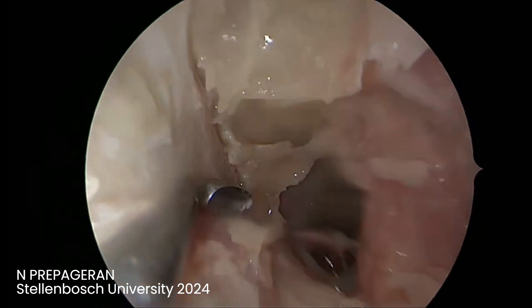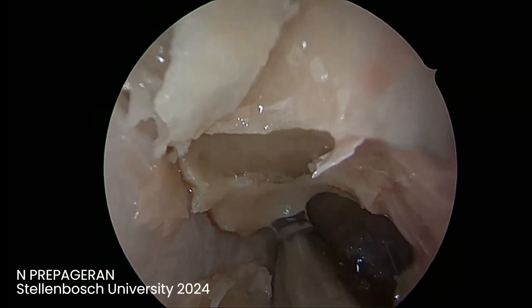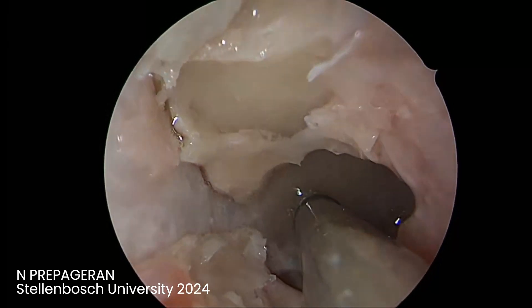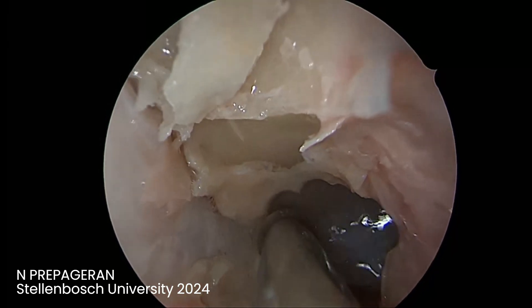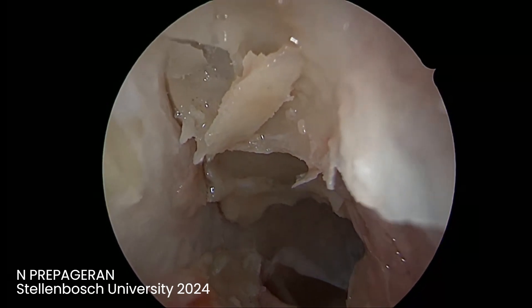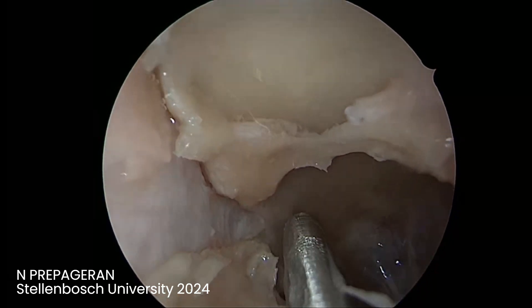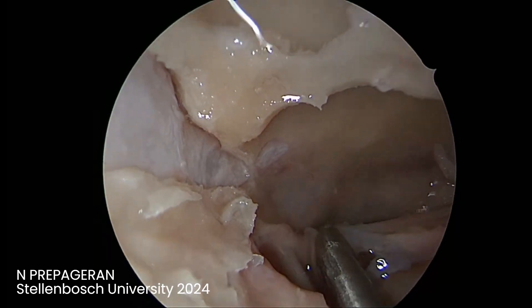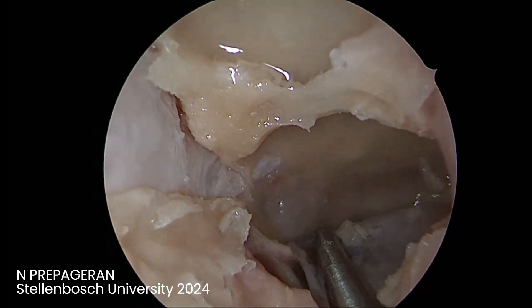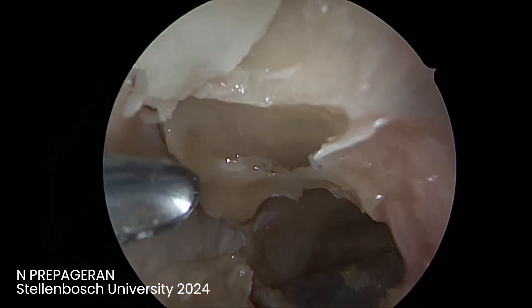This is the bone that is keeping — that's the optic nerve. Can you see the optic strut? I'm going to remove a little bit of bone, then remove a little bit of bone over the optic nerve. The idea is just to clean the bone. Can you see — now the optic nerve is exposed. I rarely have to use a burr for this.